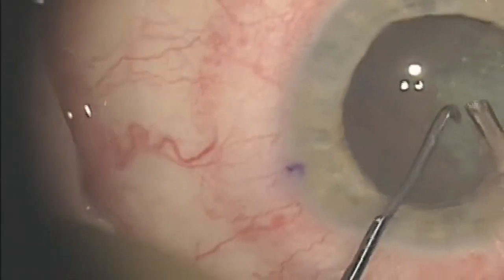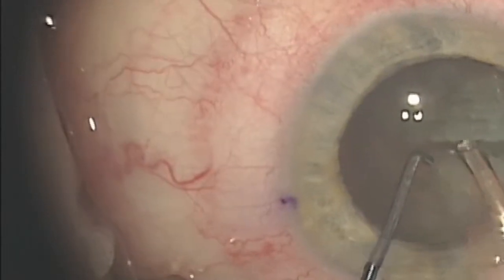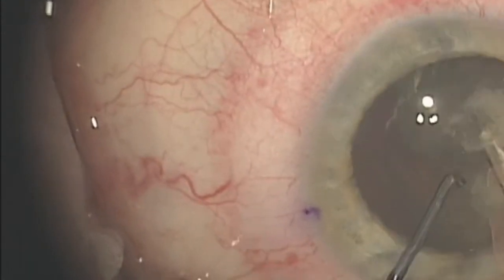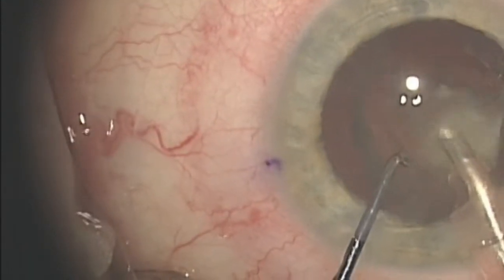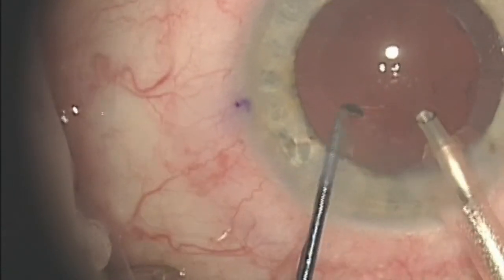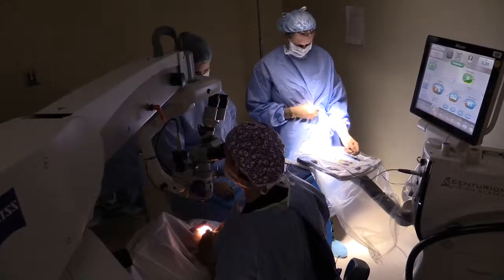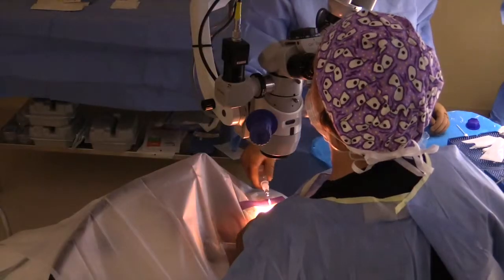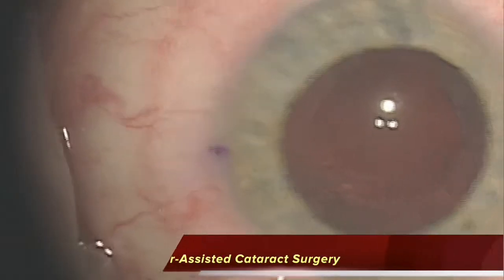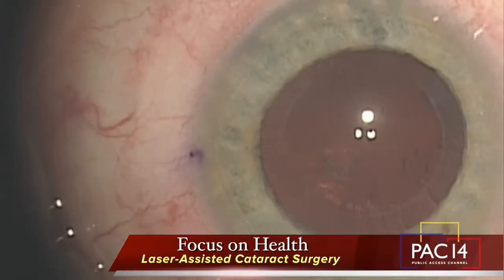We'll spin this around so I can get to it. And so you can see there how those little pieces just keep sucking right out. Okay, there's nothing left of the cataract now. All we're going to be doing now is switching to what we call irrigation aspiration to take out the remaining little bit. I/A one. Okay? Now, let's stir this out.